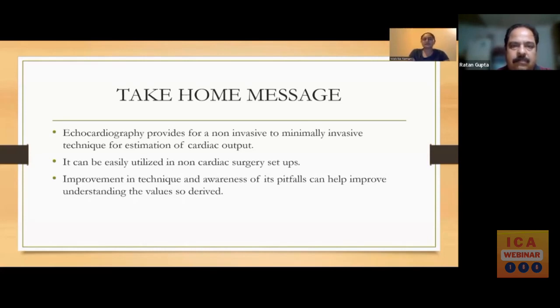So improvements in the techniques, utility of artificial intelligence, image quality and accuracy, and the awareness of all the pitfalls of this monitoring can help in understanding how to utilize it. Because at the end of the day, when we are looking at how to monitor cardiac output, while we are looking at just the accuracy, we're also looking at the trends of the cardiac output over a period of time, which is going to point out to patient recovery or deterioration.